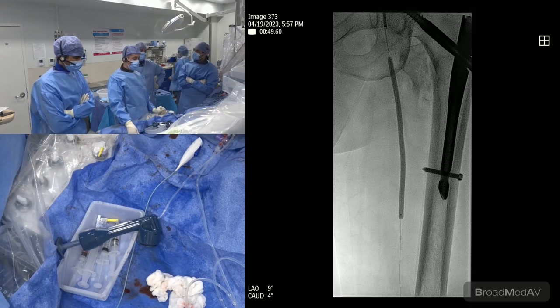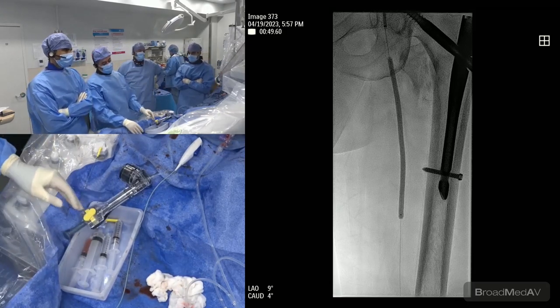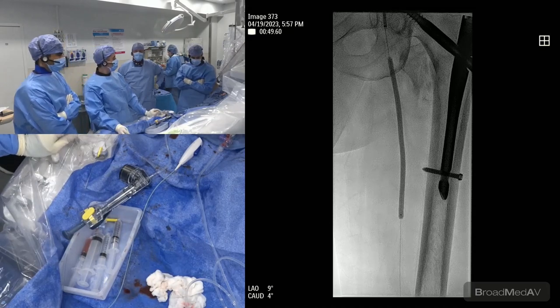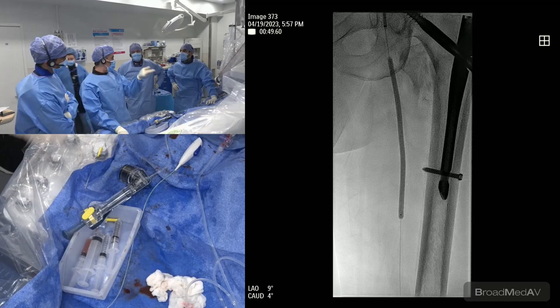Why not in this segment go straight with the drug-eluting stent? You could. It's a low fracture rate zone. I think you're totally right. You definitely could have argued to do it. We definitely could have done it.